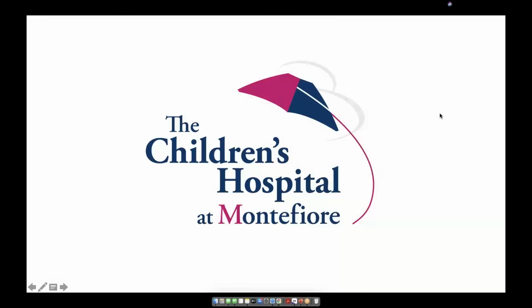Excellent. Thank you. Last question was, can you just clarify what type of VAD is available to young infants? Is it only the HeartWare and the Berlin Heart? Is that the only two that are available? So the HeartWare is still a much bulkier device that is still not available in infants, only in smaller kids, so a couple of years or older.